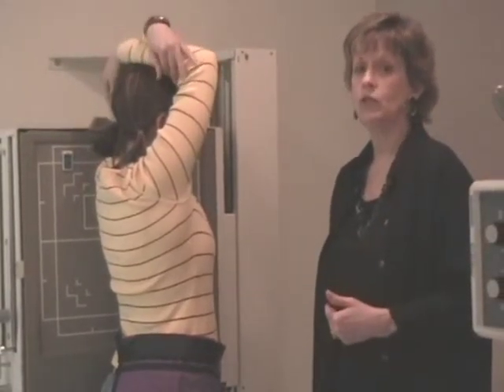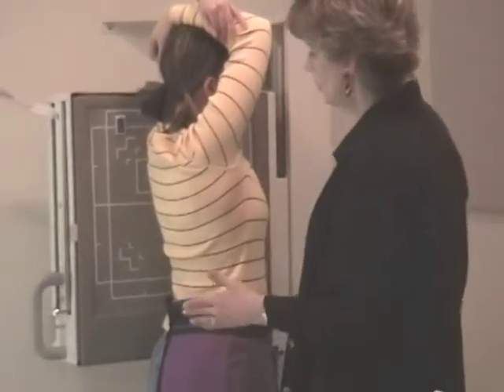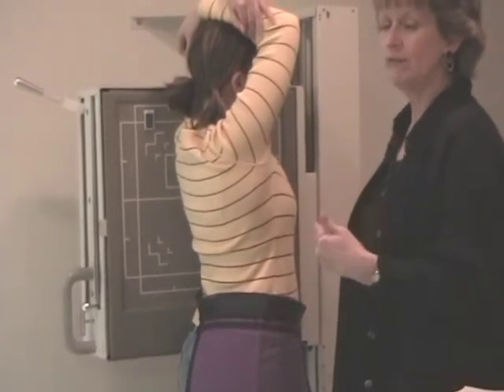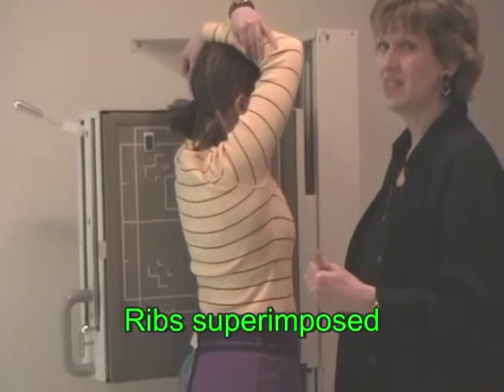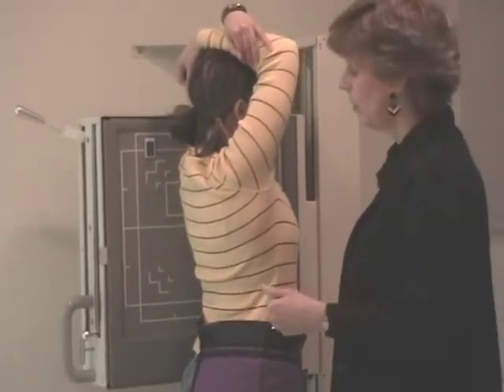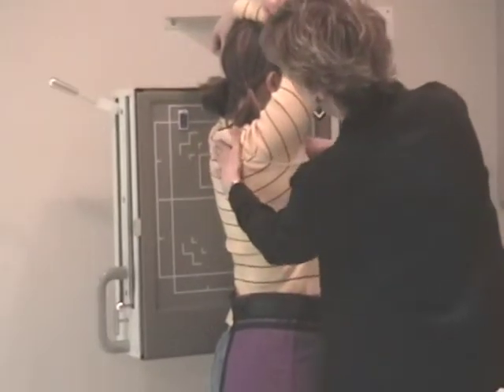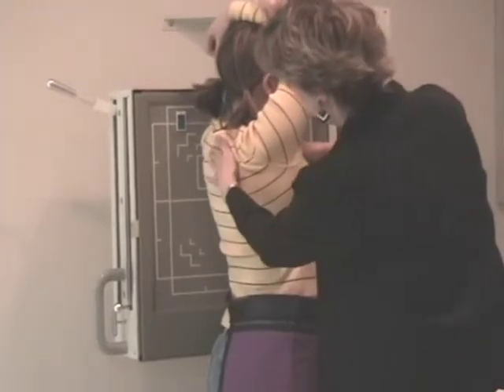That will be the positioning criteria. And to do that, the positioning criteria is I want the posterior ribs almost very nearly superimposed. To get them totally superimposed, that's the textbook perfect. But I want them as close to being superimposed as possible. So when I position the patient, I'm going to look between her shoulder blades, and I'm going to look at the small of her back.